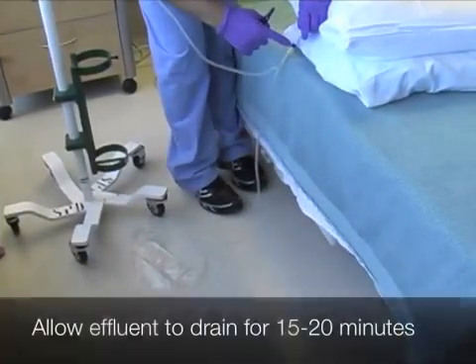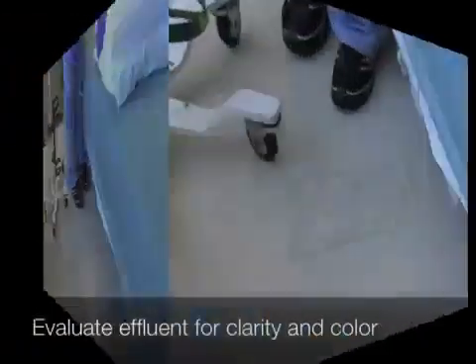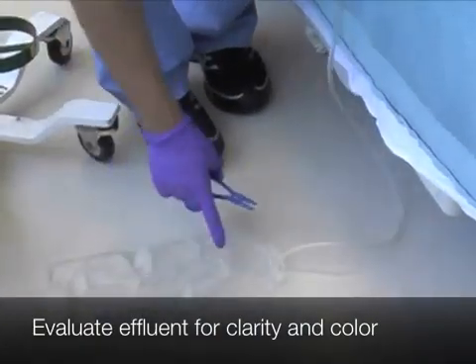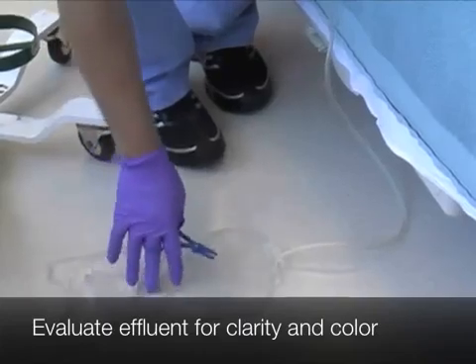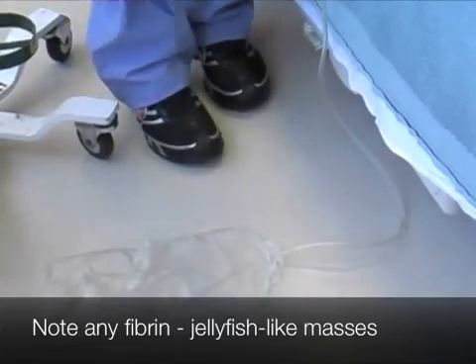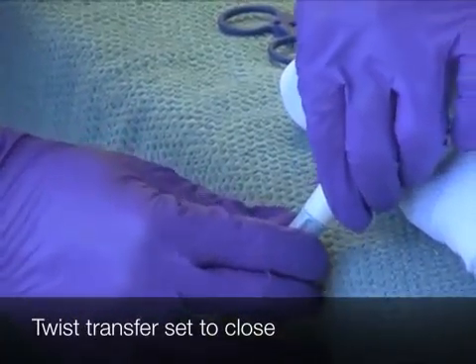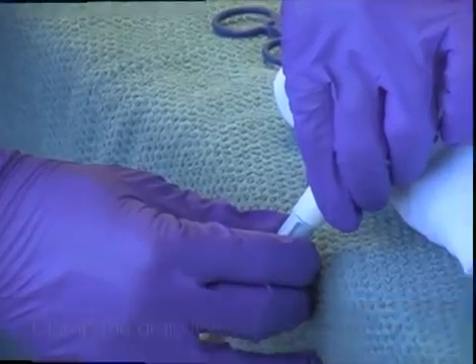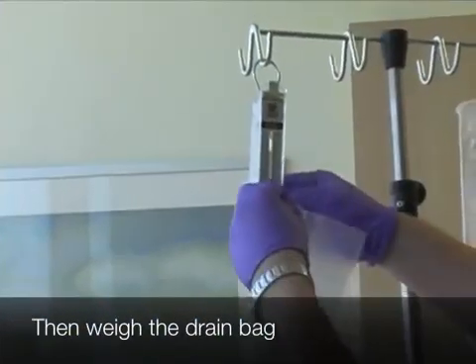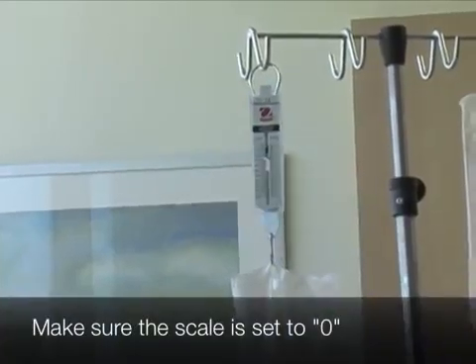Unclamp the drain line. Allow effluent to drain for 15 to 20 minutes. Evaluate drainage or effluent for clarity and color. Note any fibrin, which is a jellyfish-like mass, in the drain bag. When drainage is complete, twist transfer set to close and clamp the drain line. Weigh the drain bag and make sure the scale is set to 0.